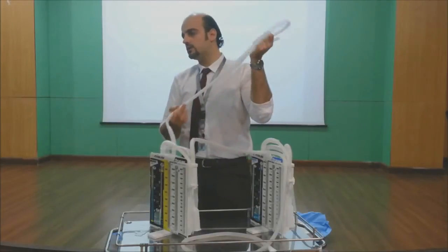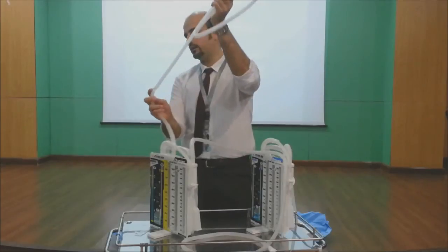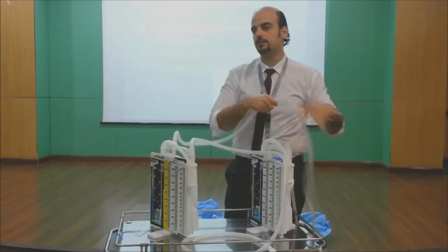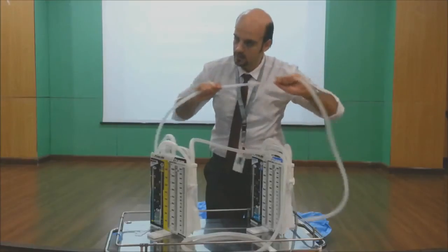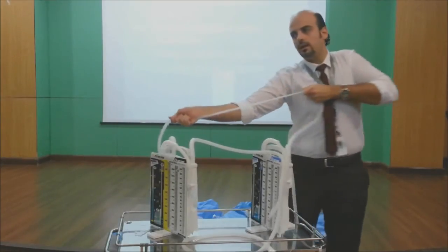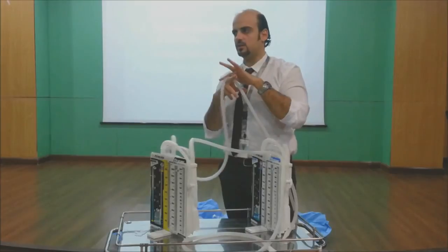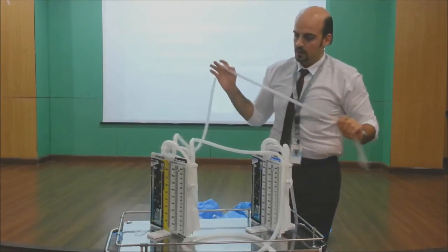How to clamp this? The best secured way I found is to tighten it like this. Just be sure that you tie it well. I can tie it like this, it's considered tight. Tie it well, this tightness. It's air sealed. And then you can cut and put some sealant on it like I'm doing, to be sure.